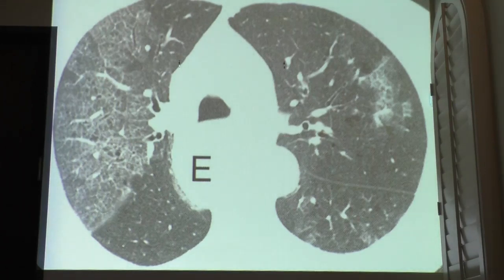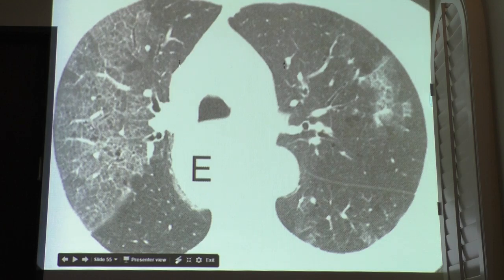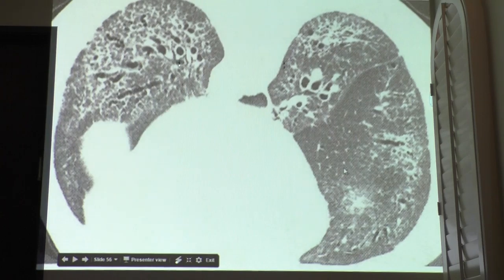So this is actually ground glass. You see, it's just at the beginning of the process. So when you see an x-ray like this, a CT like this, and you see that the process involves both lungs, it is more likely to be some sort of idiopathic or autoimmune process, but you can also see it in infection. But when you see a lot of little nodules everywhere, you think about metastatic disease. That's one of the things to consider. So this is a more severe spectrum of disease.